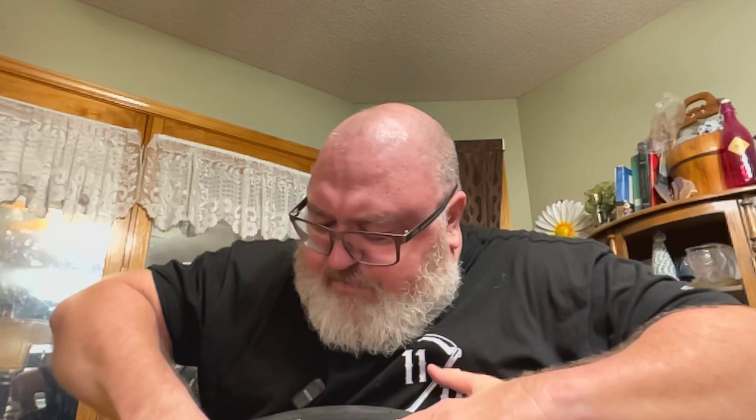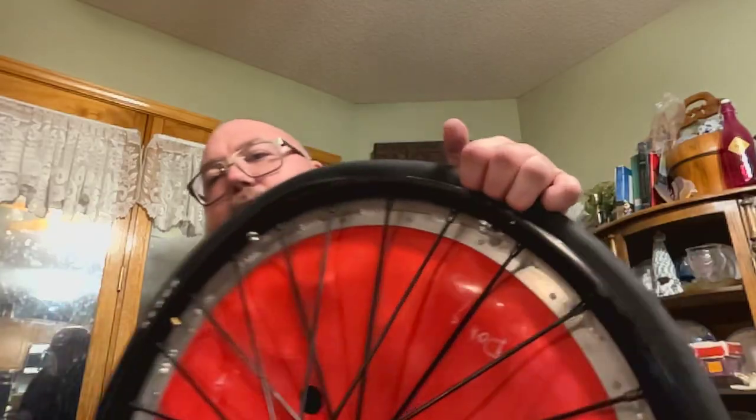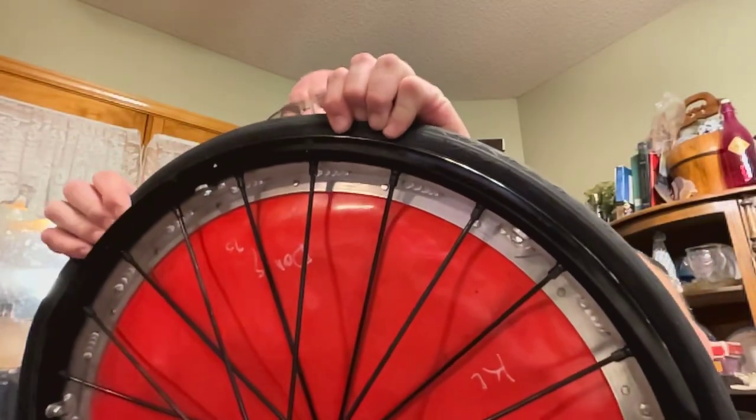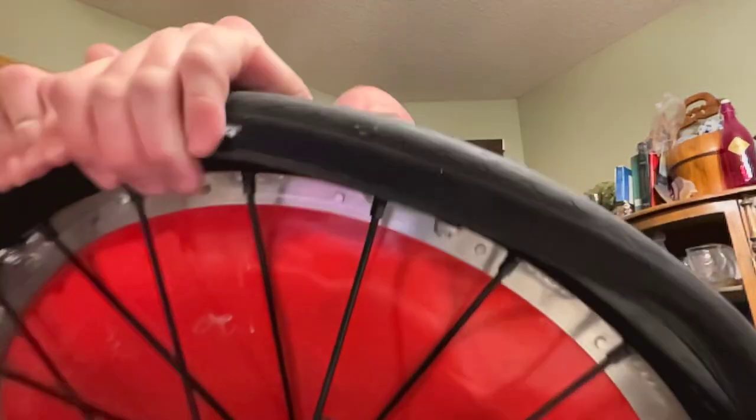So I've got it about as far as I'm going to be able to get it without deflating the tire completely. Yesterday I was talking about, hey, I completely deflate the tire. Give me some more room. So that's what I'm doing here. When I do that, I go ahead and work that tire again. So I'm working all the way around as much as I can. What that's doing is seating that tube and tire actually inside the channel of the rim. So theoretically, it should snap into place.